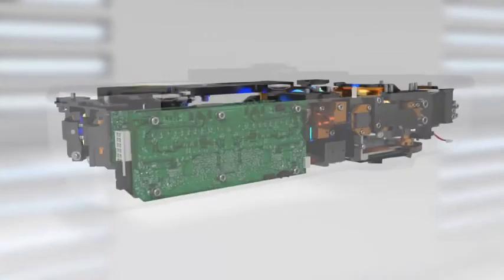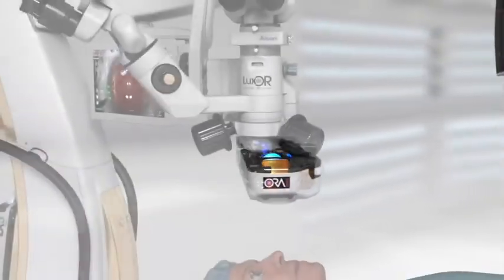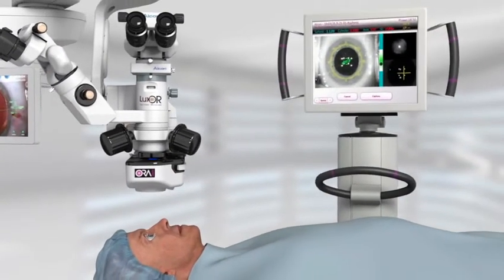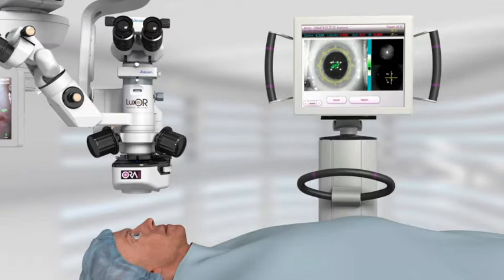By providing real-time refractive information in the OR, the ORA System with VerifEye+ technology helps identify posterior corneal astigmatism and provides additional information that may not have been detected during pre-op analysis.